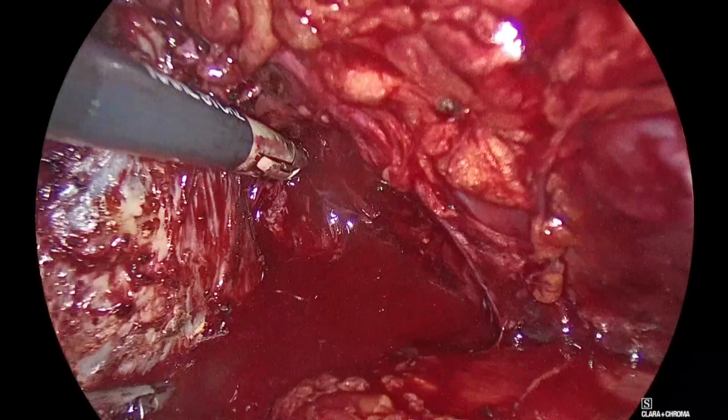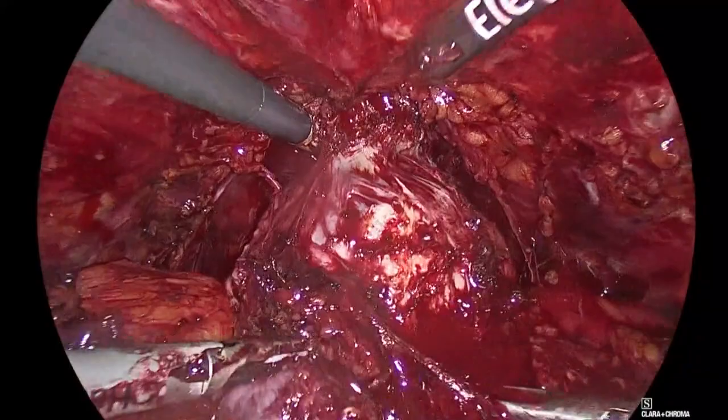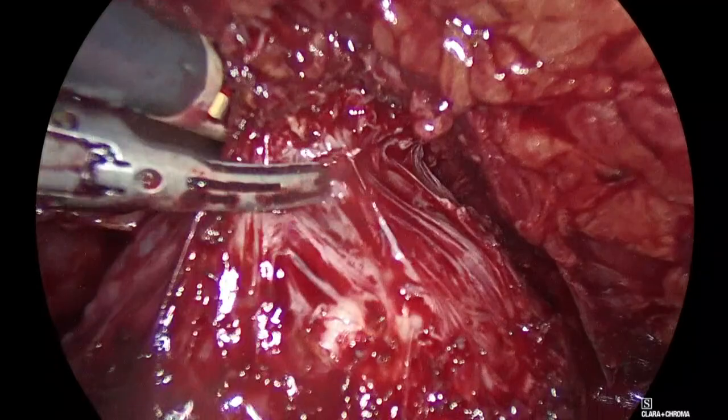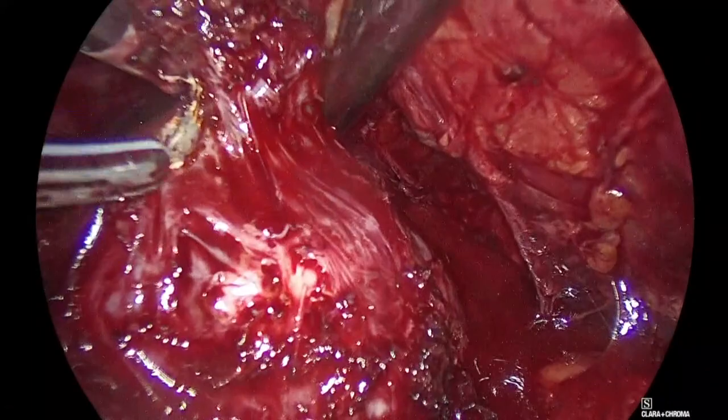Look at the move here. There. Dissection like this. Yes. Correct. Go centrally. Leave this to me. Grasp the prostate, Panagiotis. Nice. Centrally. Good. Come here. Grasp it. Nice. Come close. Good. Nice. See, we're getting this is the field we need to go into. You see this? Is this clear, Alan?